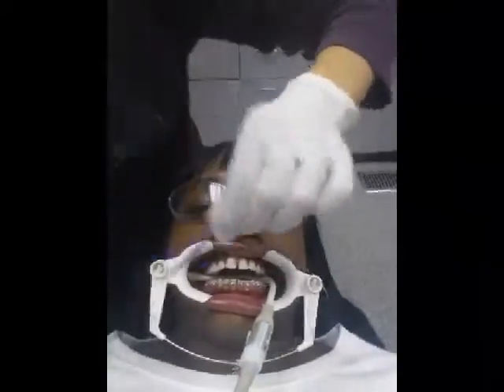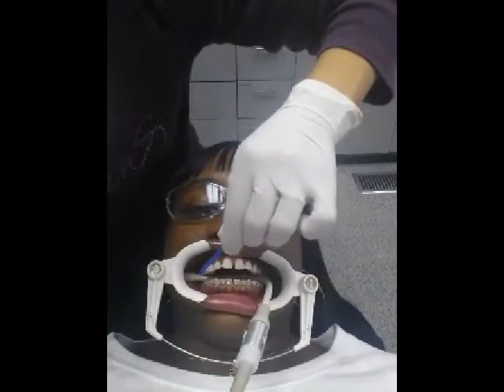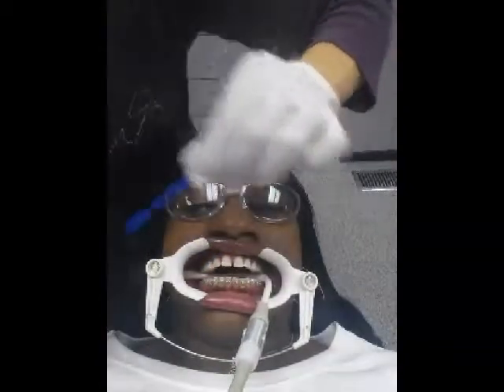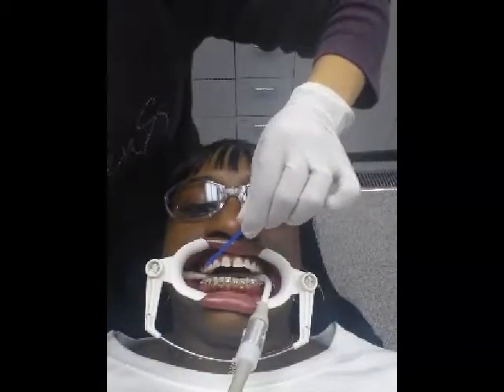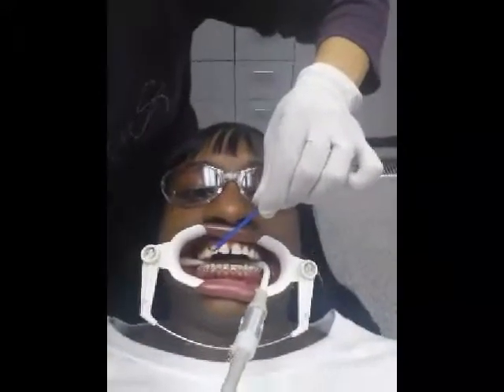And that stuff she rubs on each tooth with a little blue stick, I believe that's the primer for the glue. And she pretty much rubs that around each tooth thoroughly before she puts the glue on the bracket and places the bracket on each tooth.